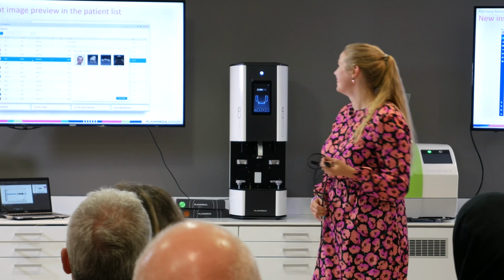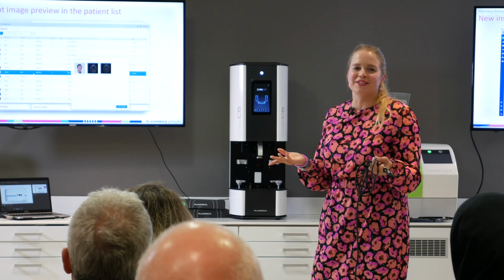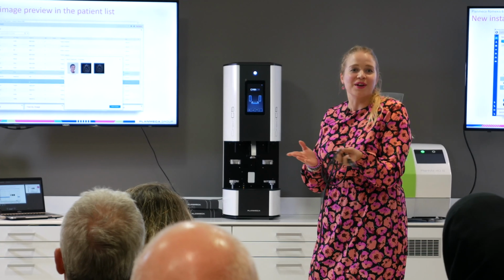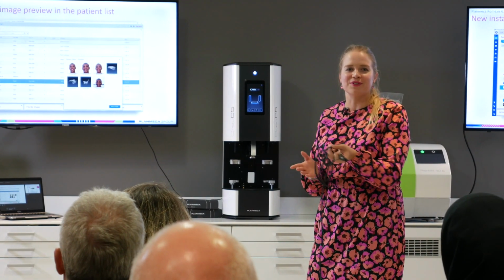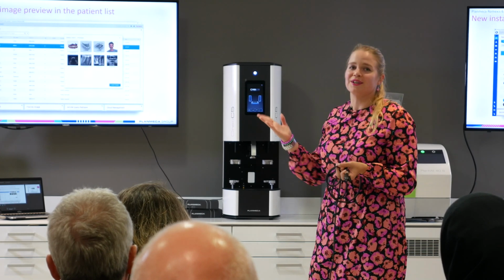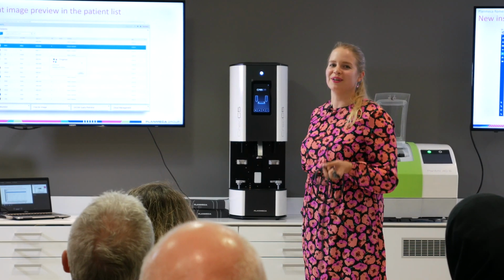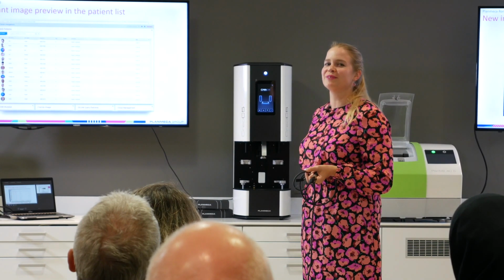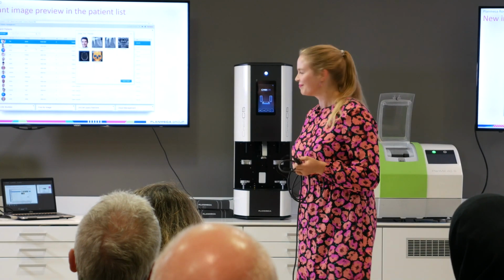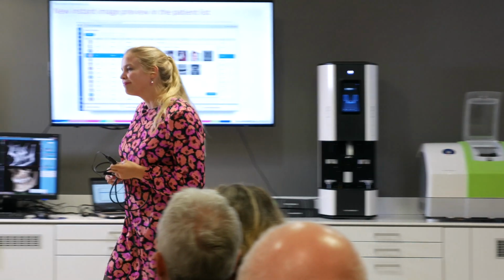Well, I can put that, but like I said, that's the problem. It would be so hard to localize the same software for all different markets. So yeah, unfortunately, I think Romexis will be imaging software, but anyway, it can integrate all the images at least in the same software. Just about the mobile app, what's the system requirements?